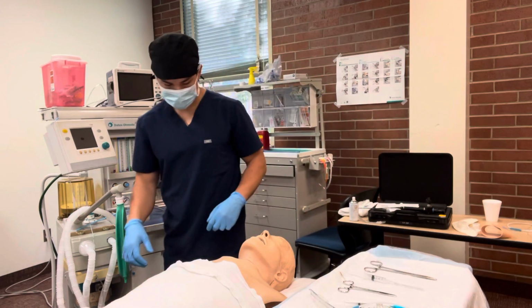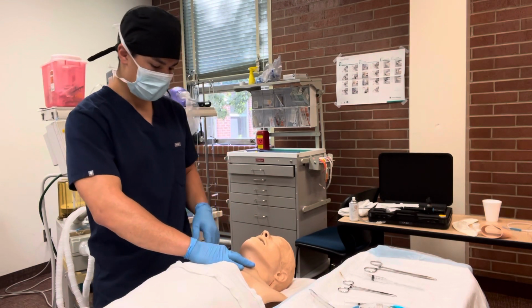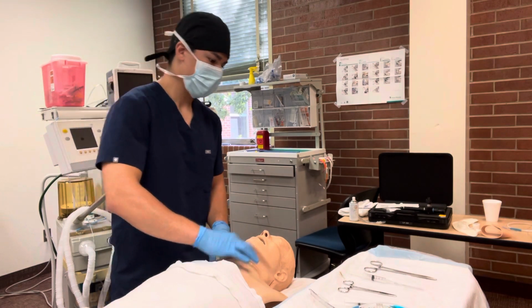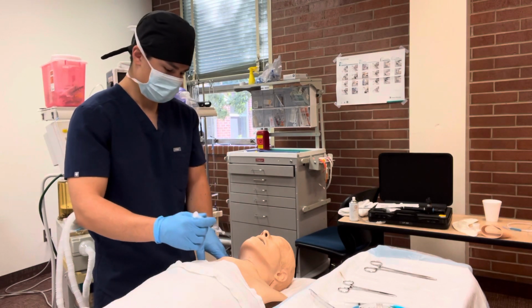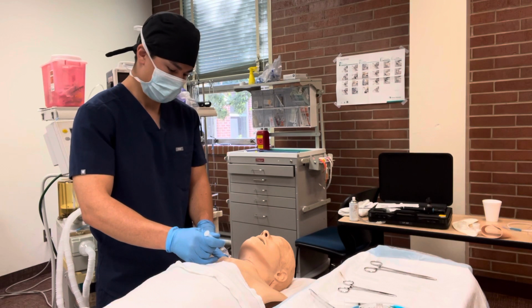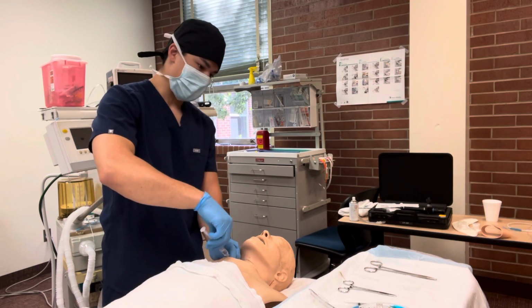So I'm going to position my patient, palpate for the cricothyroid membrane. I'm going to clean that site off. I'm going to localize this site if my patient's awake, but they're not. I'm going to take my syringe and needle and insert it in a cephalad direction through the cricothyroid membrane while aspirating for air. Got air there.